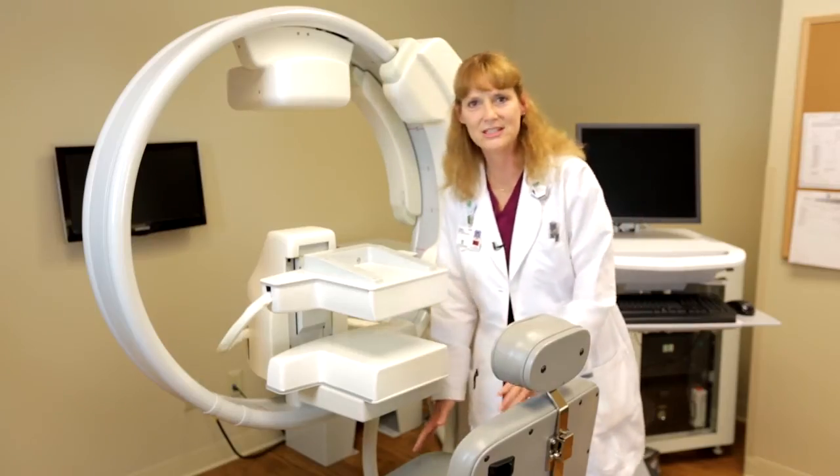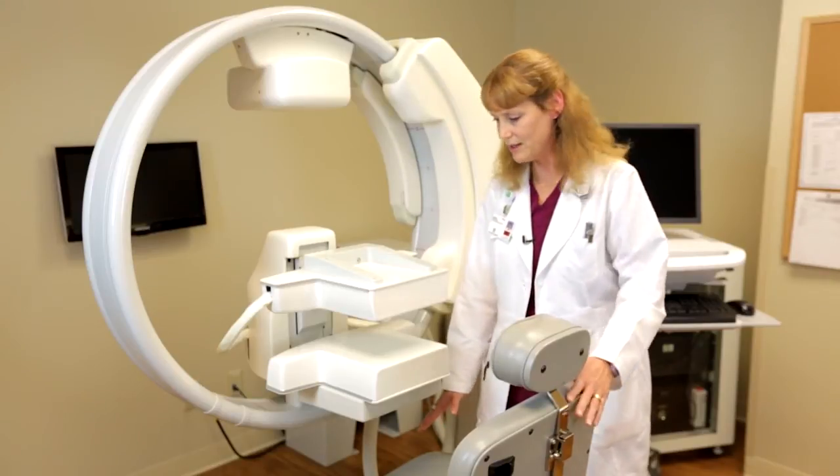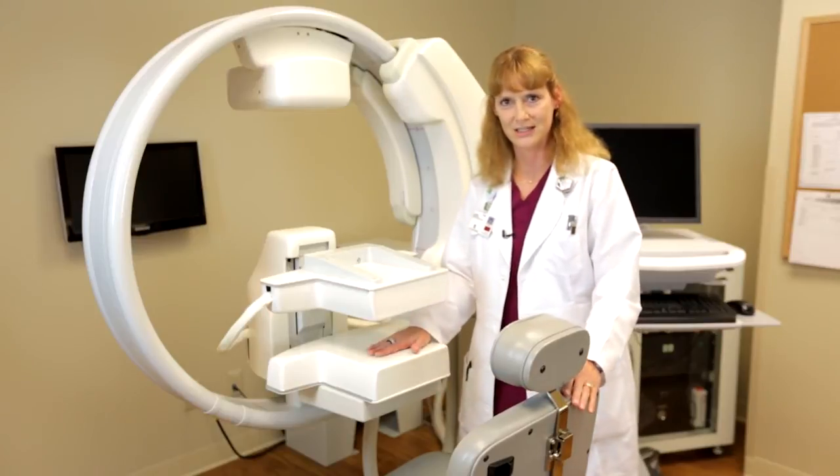First, we would inject the patient with a small amount of sestamibi. After approximately five minutes, we would get the patient seated comfortably in the chair. We would start with the CC view, bringing the patient close to the detector, resting their breast on the lower detector.